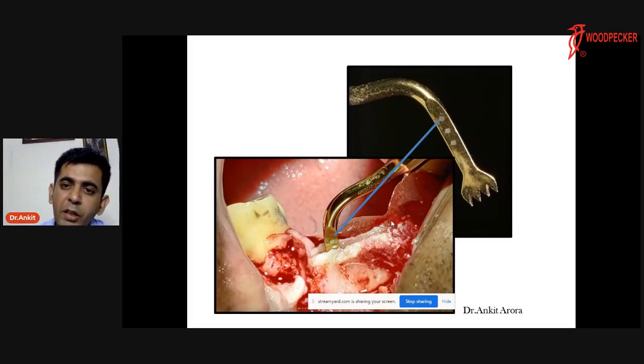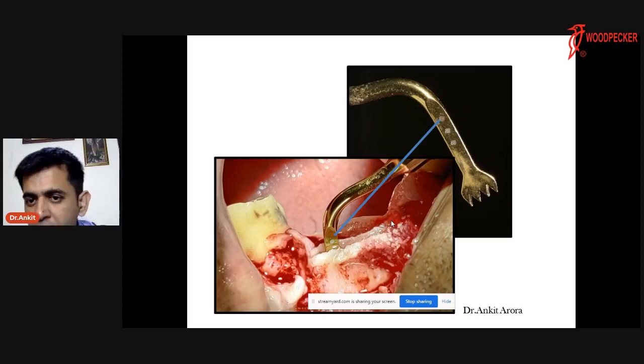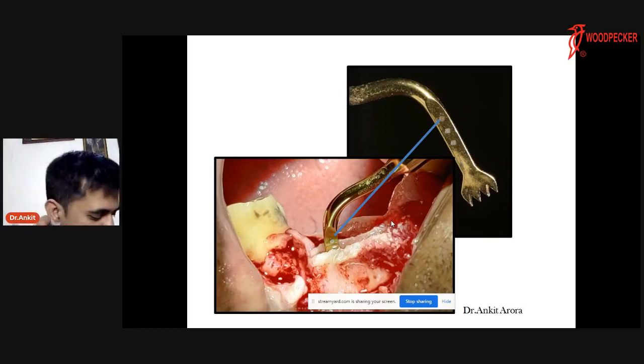As we have already calibrated, we need to go till 11.5 mm to the nasal floor in the 2-3 region, in the left upper canine region. So you can see in the ridge split area, we have taken a proper diagram, and we have gone till 11 mm height. In such a scenario, these things are very helpful in doing implantology in delicate cases like this.